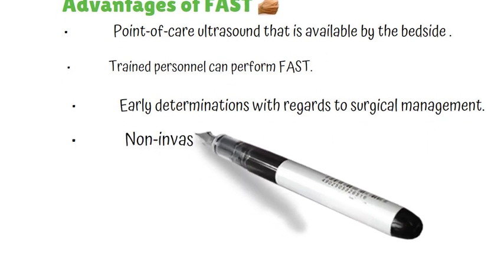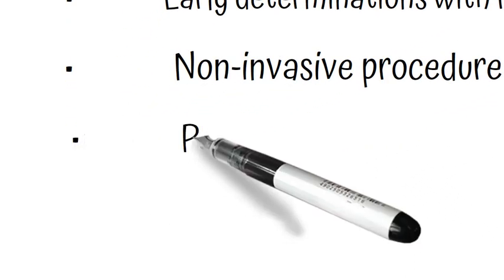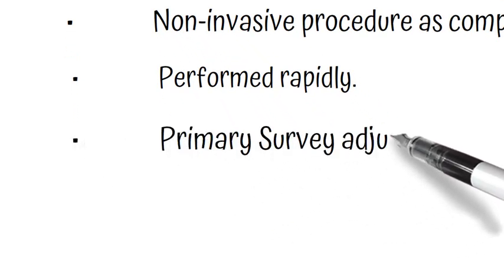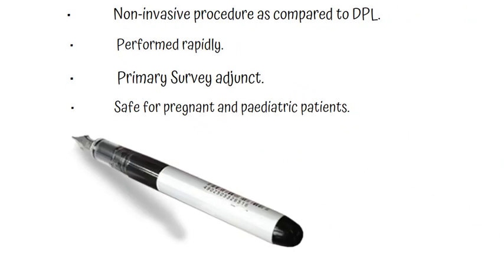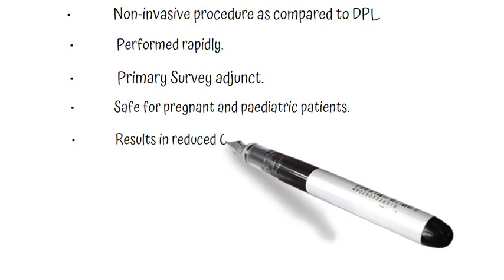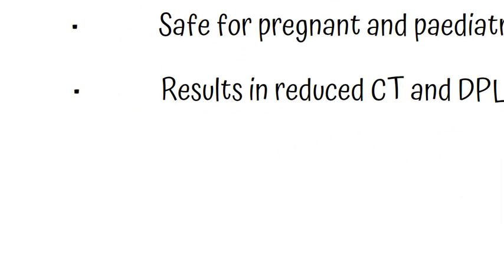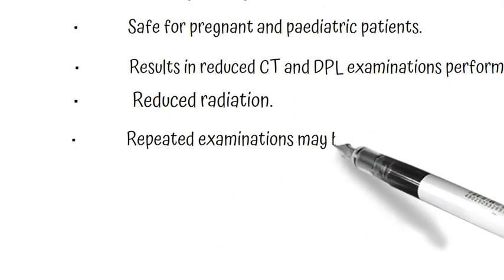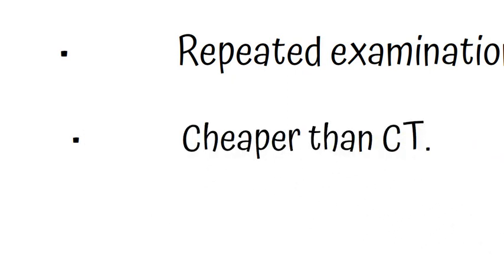It is a non-invasive procedure as compared to DPL. It can be performed rapidly. As already mentioned, it is the adjunct to the primary survey. It's safe for pregnant and pediatric patients. It results in reduced performance of CT scans and diagnostic peritoneal lavage examinations. No radiation to the patient. Repeated examinations may be performed without concern of radiation exposure. Of course, it is cheaper than a CT scan.